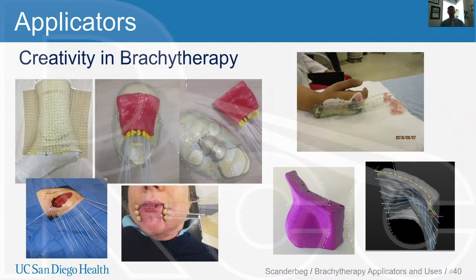Okay, so I do want to mention creativity in brachytherapy. I think it's really important to talk about creativity. There are so many more variables in brachytherapy compared to external beam radiotherapy, and it's important to remember those options and not get stuck with very rigid thinking. We want to think outside the box. Treatment options don't have to be limited, especially with evolving technology.